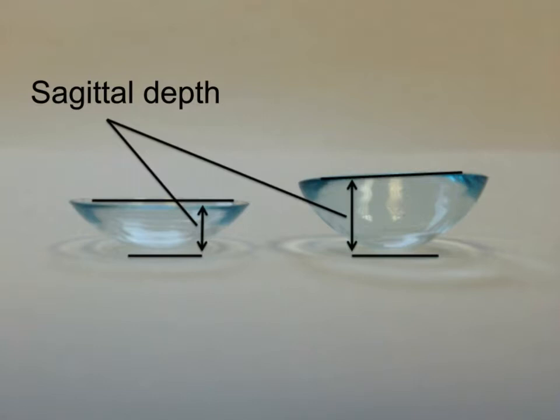Not only are these contact lenses remarkably comfortable, but they correct these highly irregular corneas. They're based on a principle that's very different than traditional contact lenses, because these lenses actually vault the cornea. So they're based on a principle of sagittal depth. Now, what you're looking at here is how we used to measure central corneal clearance over our corneas with patients who are wearing scleral lenses. On the left-hand side is the contact lens of this optic section. In the middle of the optic section, you can see the fluorescein pattern that represents the central corneal clearance. And on the right-hand side of the optic section, you can see the cornea.